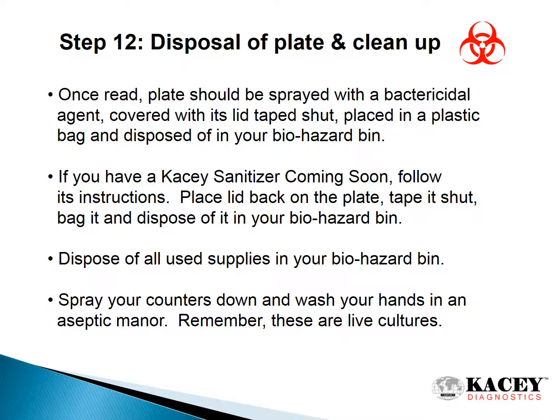Step 12. Disposal of plate and cleanup. Once read, plate should be sprayed with a bactericidal agent, covered with its lid taped shut, placed in a plastic bag, and disposed of in your biohazard bin. If you have a Kacey sanitizer, follow its instructions. Place lid back on the plate, tape it shut, bag it, and dispose of it in your biohazard bin. Dispose of all used supplies in your biohazard bin. Spray your counters down and wash your hands in an aseptic manner. Remember, these are live cultures.